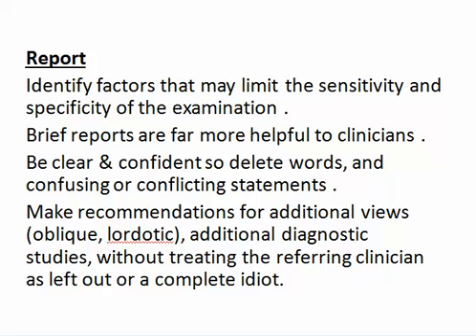Identify factors that may limit the sensitivity and specificity of the examination. Brief reports are far more helpful to the clinicians. Be clear and confident, so delete weasel words and confusing or conflicting statements. Make recommendations for additional views if you want, oblique, lordotic, or additional diagnostic studies, without treating the referring clinician as left out or a complete idiot. This is how to report a chest X-ray or any other.